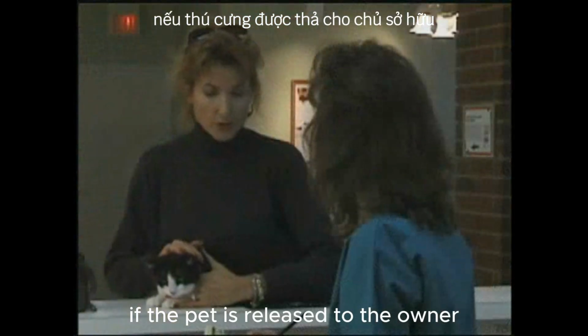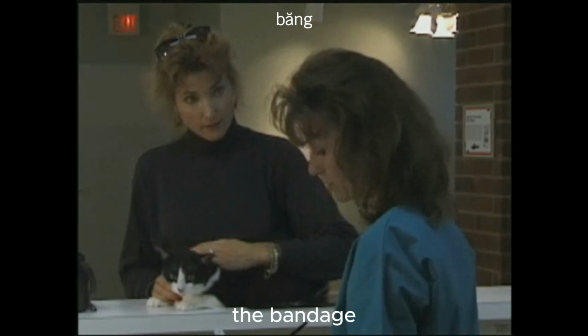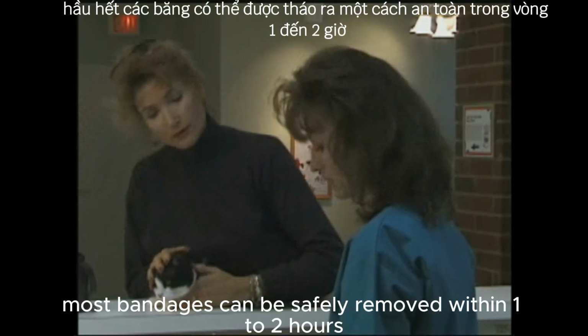If the pet is released to the owner, be sure to give the owner proper instruction on when to remove the bandage. Most bandages can be safely removed within 1 to 2 hours.